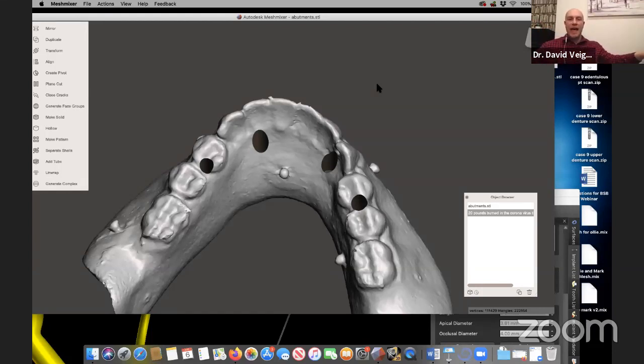And the lab will have now a physical scanned prosthesis that they can scan immediately. They'll have articulated models in the right vertical dimension. If it's not in the right vertical dimension, I change it by adding wax or reducing, whatever. And the next stage is I then go back to the patient with a 3D printed try-in. I print 2 of them.